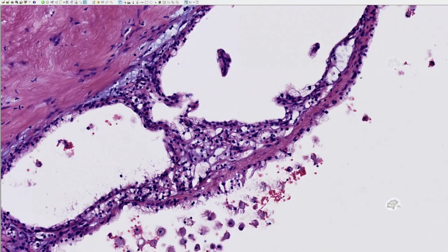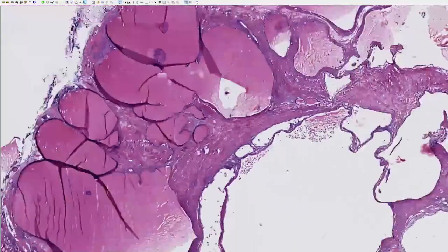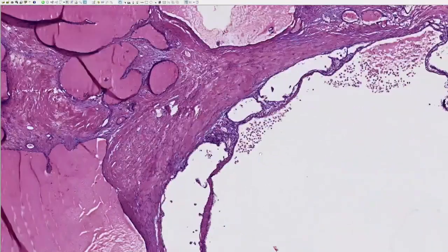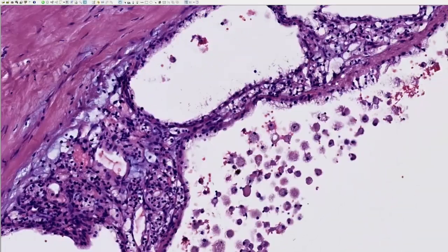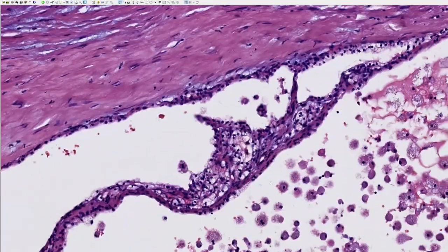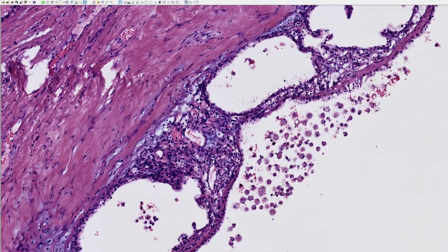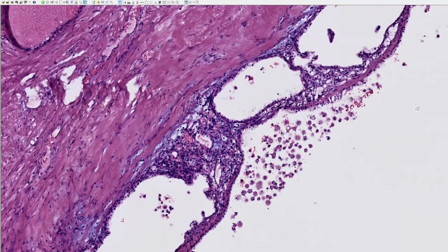Notably, there is no necrosis. The tumor is entirely cystic with no increased or atypical mitotic figures. We can now reveal the diagnosis: this is a multilocular cystic renal neoplasm of low malignant potential, or MCRNLMP — admittedly a mouthful. MCRNLMP is an indolent renal tumor that is entirely cystic.